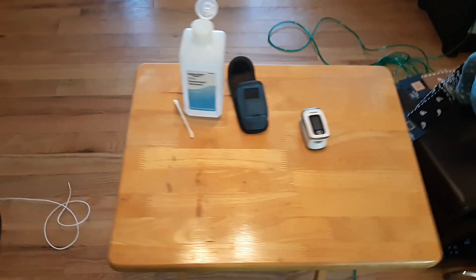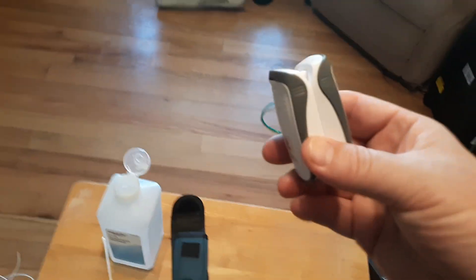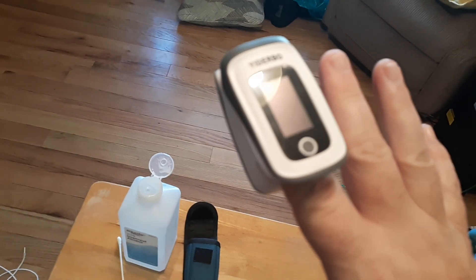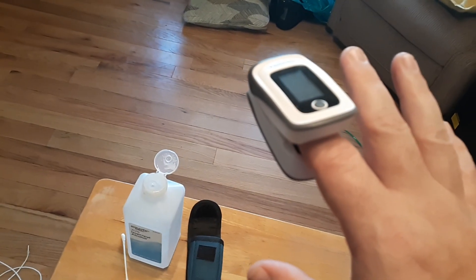Greetings! In this video I want to help you troubleshoot an oximeter oxygen pulse reader that no longer works. It doesn't power on, doesn't turn on, and of course an oximeter measures the blood oxygen level in your body.